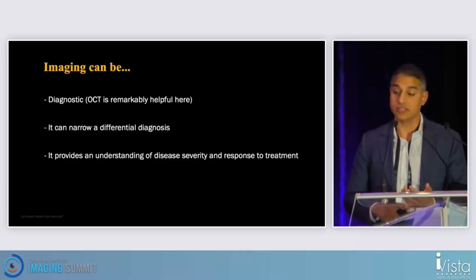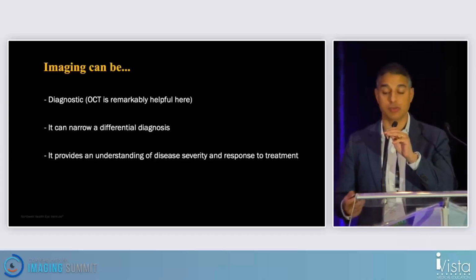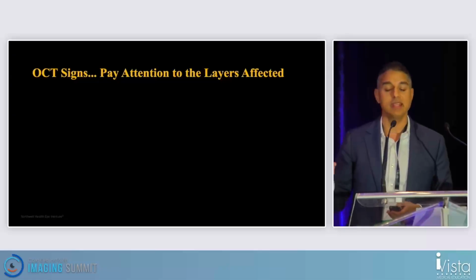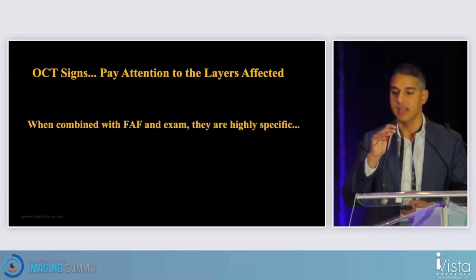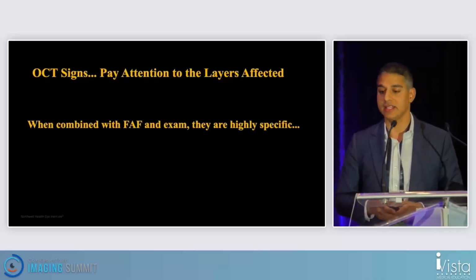I think diagnostically it's really important. OCT is remarkably helpful here. It can narrow a differential diagnosis, and it provides understanding of disease severity and response to treatment. So let me show you a couple of cases. With OCT signs, pay attention to the layers affected. And when combined with fundus autofluorescence and exam, these are highly specific.